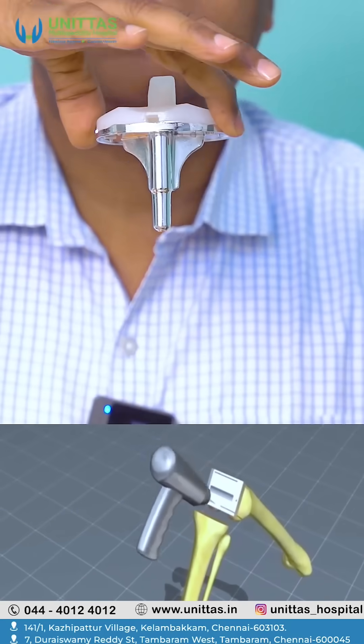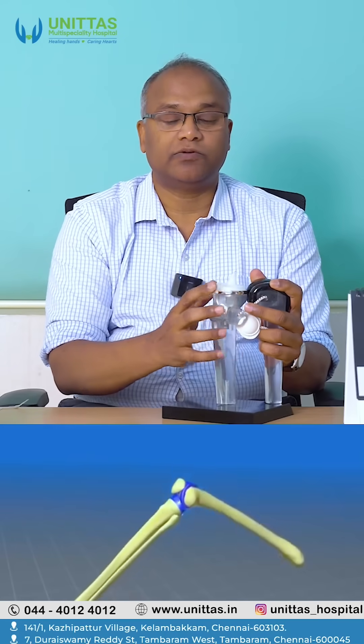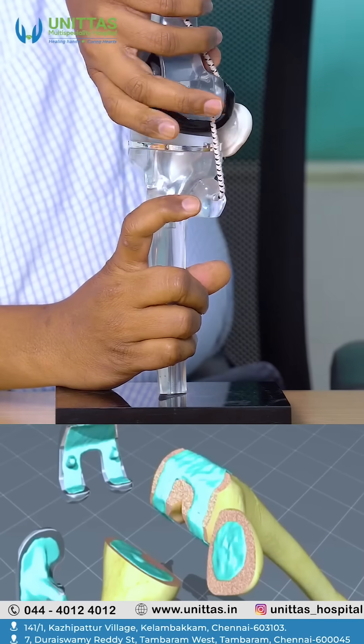The lower part also looks like this in real. This is also prepared for the lower tibia bone and then pressed fit into it. This is fixed with the help of bone cement. Cement is placed inside the bone so that this gets attached.